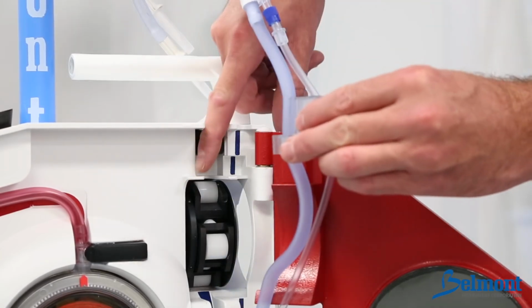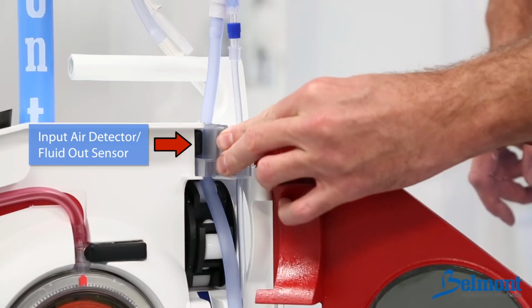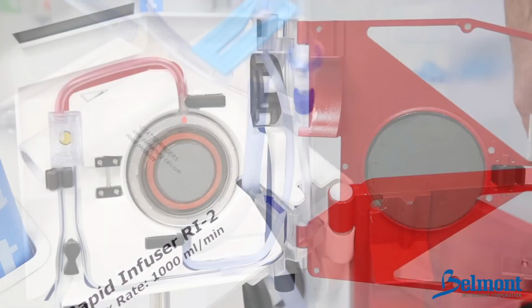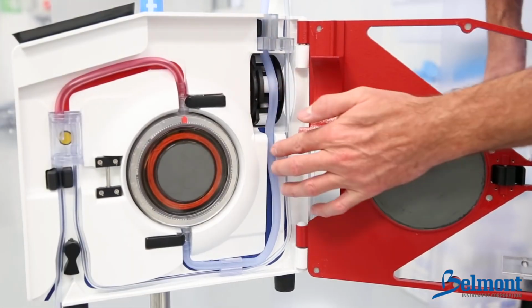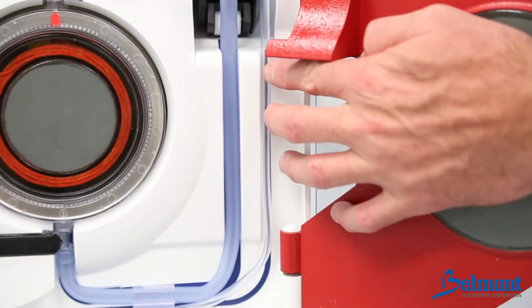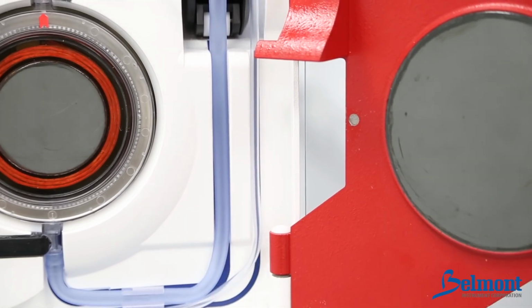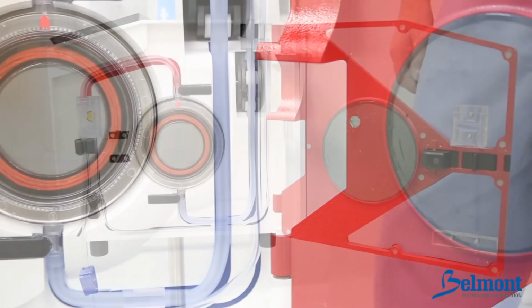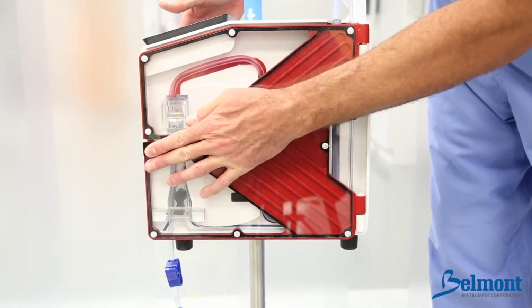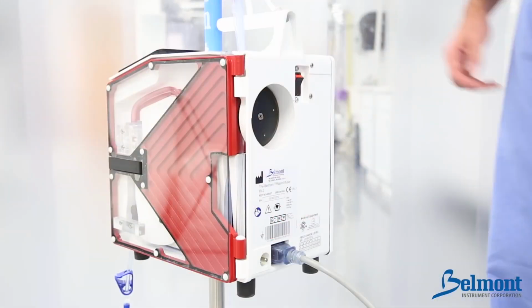Next, fit the interlock block on top of the shelf. The blue arrow should be upright, pointing towards the ultrasonic air detector. The interlock block will be flush with the top of the machine. Thread the wider tubing over the center of the roller heads. Make sure that the larger tubing is in the groove of the wider blue line and the smaller tubing is in the groove of the thinner blue line. Avoid stretching, kinking, and cross-threading the tubing. Finally, close and latch the door, making certain the pump tubing is not caught. You are ready to power on the system.